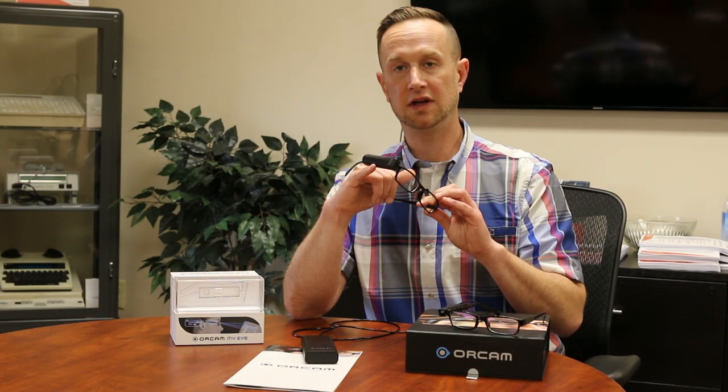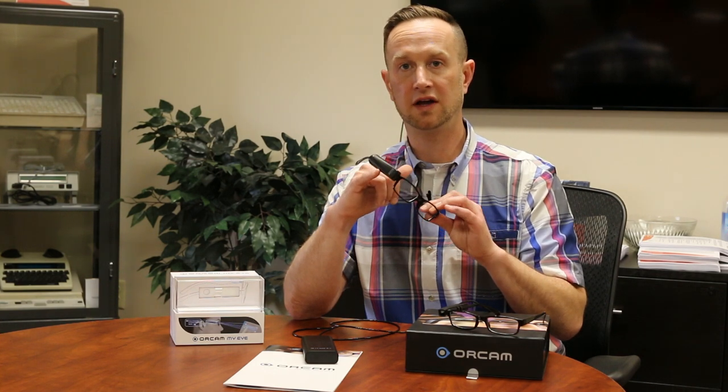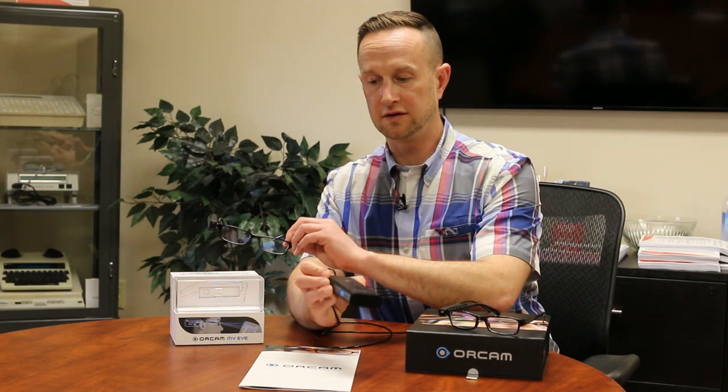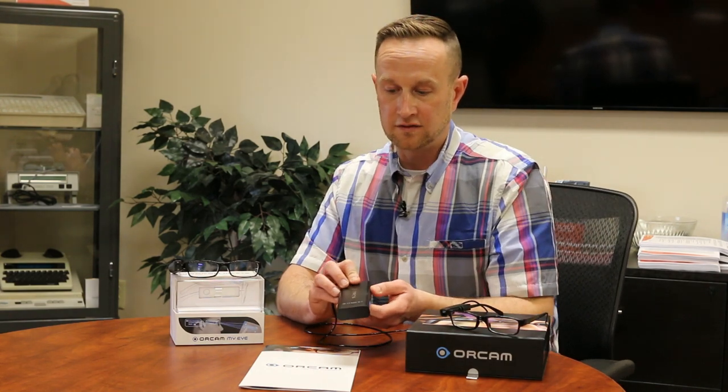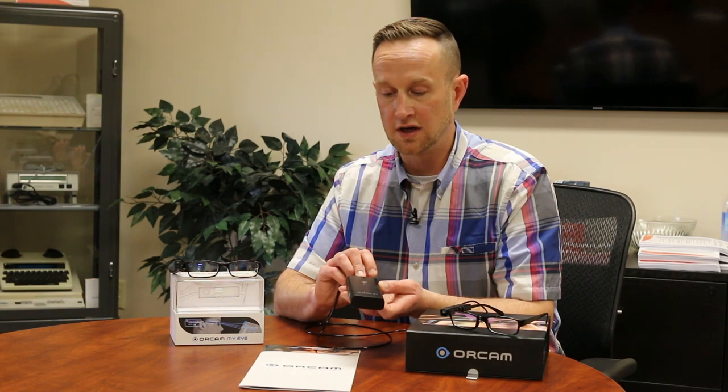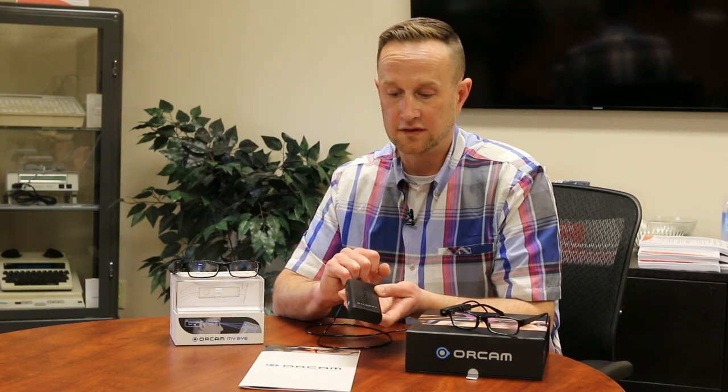For updates, the MyEye 2.0 connects to Wi-Fi and downloads updates directly to the device — very simple. With the wired OrCam, updates are sent on an SD card. You pop off the bottom, swap out the old SD card for the new one, and the device is updated. As new improvements and additional UPC codes are added, you receive them. You get three updates with every new device.